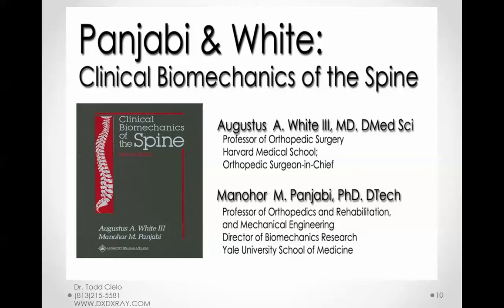So this is where it all began in the mid-70s, 1975. White and Panjabi did some cadaver studies. They did 8 of them. They found out, let's just talk about the cervicals, make it easy. They found out that the cervicals at 3.5 millimeters of translation, which is that forward-backward motion, and 11 degrees of angular motion, was clinically significant from an anatomical standpoint. They said it was inconclusive, but they said it was significant. In 1978, they created their first edition of Clinical Biomechanics of the Spine, and they confirmed it, that 3.5 and 11 degrees were significant. Any questions thus far?